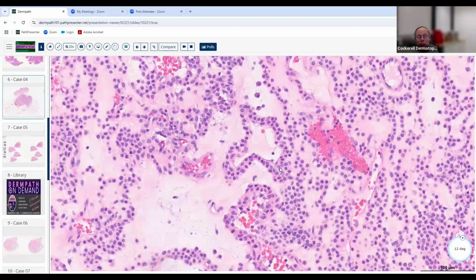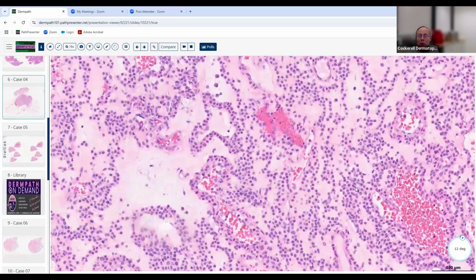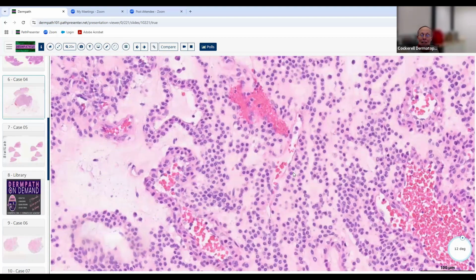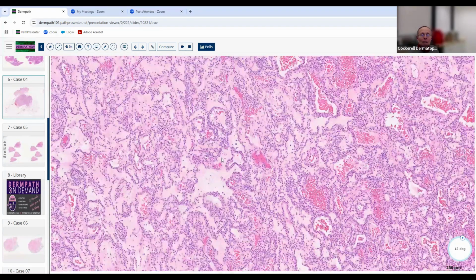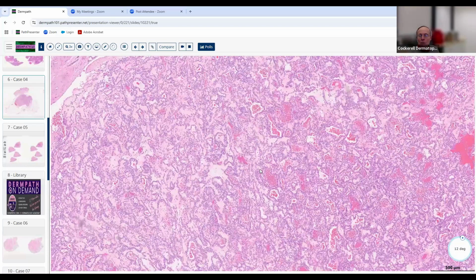But just like anything else, sometimes those glomus cells can form a neoplasm. And in this case, they have formed a neoplasm. And so here, these little cells look very, very much like they're clones or identical. Just think of Star Wars, the Battle of the Clones or whatever. When you see these cells that look very, very similar to one another like this, you should be thinking of a glomus tumor, okay? And there's two types of glomus tumors.